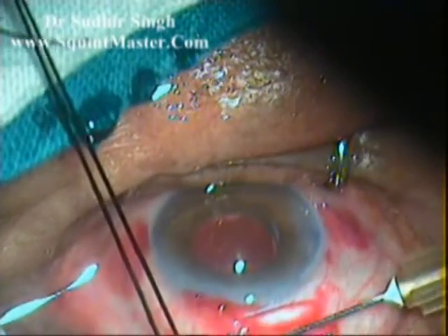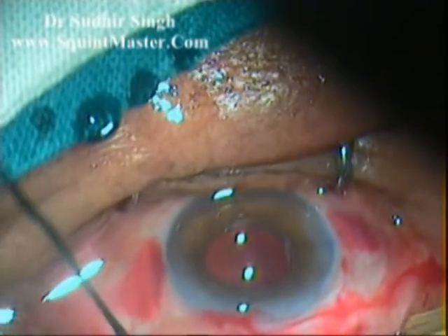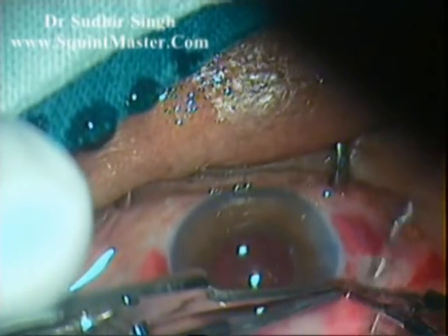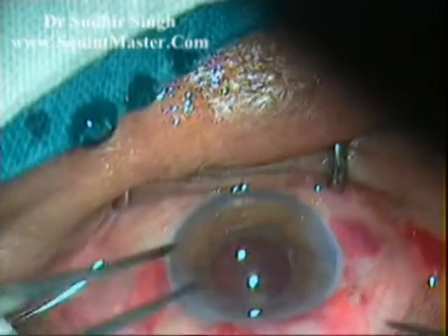The conjunctival flap is reposited back. A subconjunctival injection of gentamicin and dexamethasone is given. The cut ends of the conjunctiva are sealed with cautery.